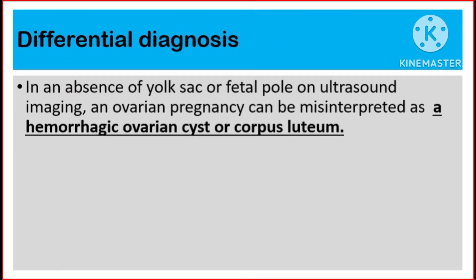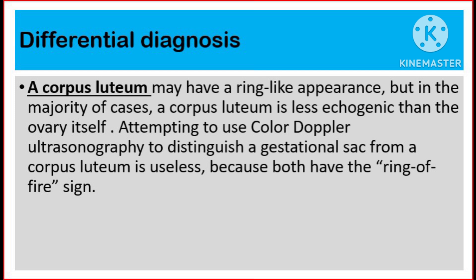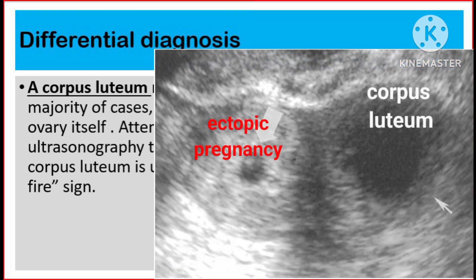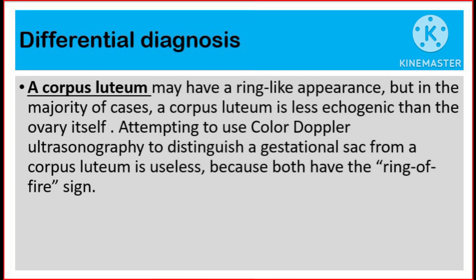Differential diagnosis. In the absence of a yolk sac or fetal pole on ultrasound imaging, an ovarian pregnancy can be misinterpreted as a hemorrhagic ovarian cyst or corpus luteum. A corpus luteum may have a ring-like appearance, but in the majority of cases, a corpus luteum is less echogenic than the ovary itself. Attempting to use color Doppler ultrasonography to distinguish a gestational sac from a corpus luteum is useless because both have the ring of fire sign.